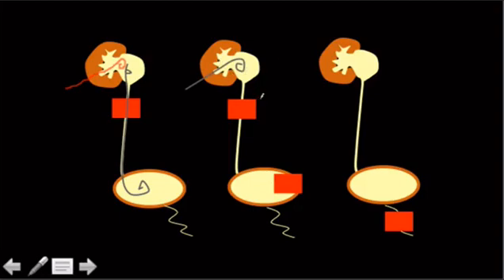Now, long-term, maybe he needs an ileal conduit or something, and then you could put one of these from here down into his ileal conduit, and that would be better for him so he doesn't have a tube hanging out of his back. But in the meantime, he's going to end up with one of these.